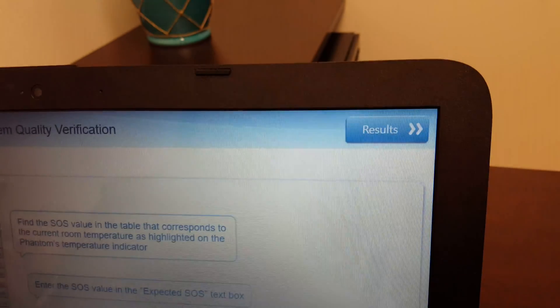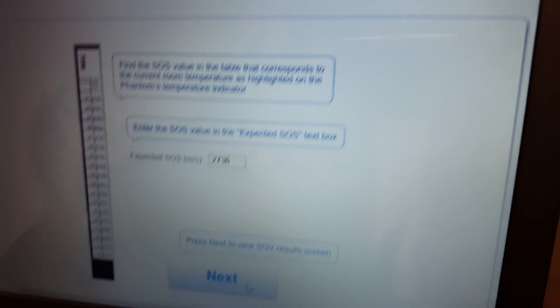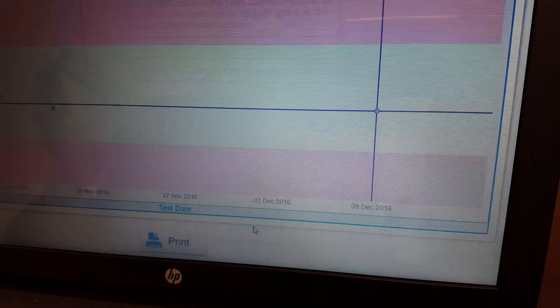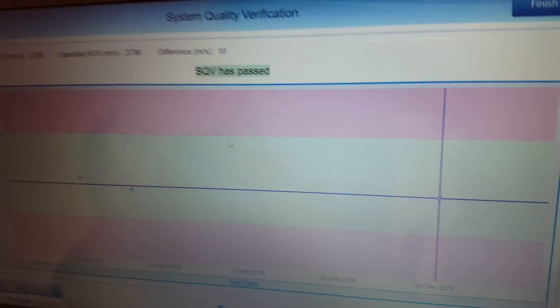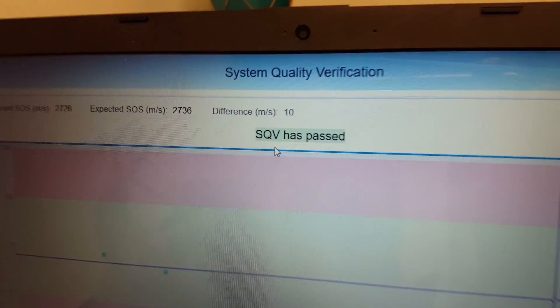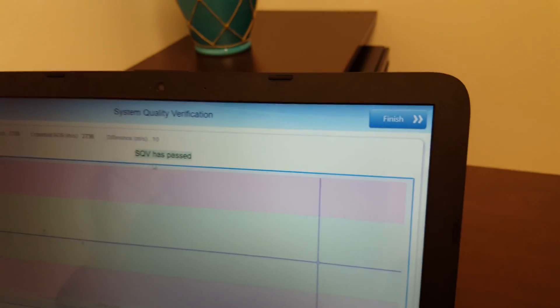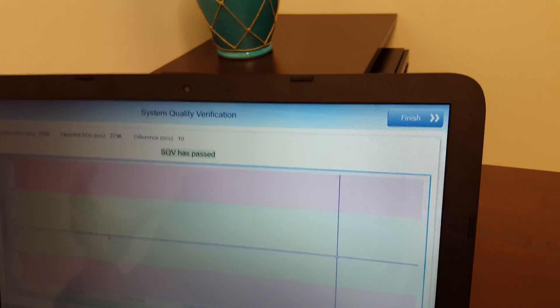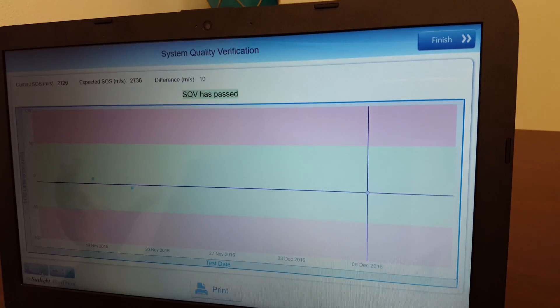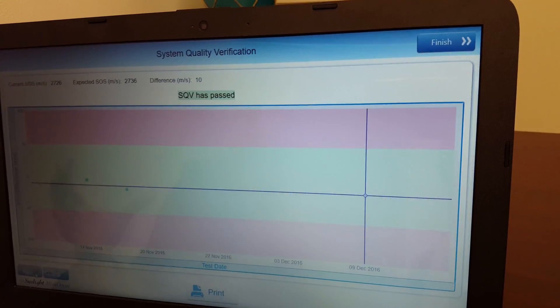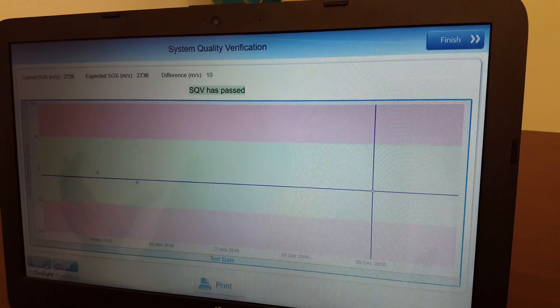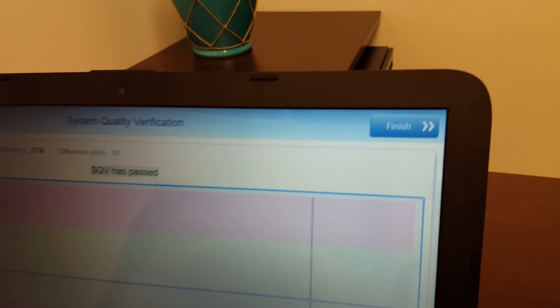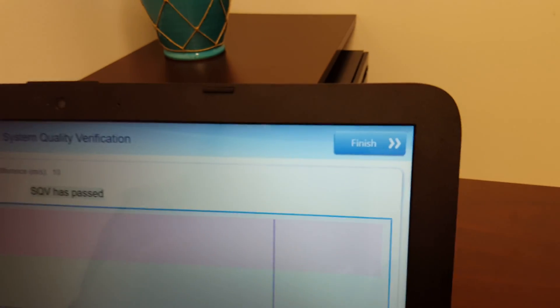And then simply press next, and it will let you know that the SQV has passed, and then the yellow triangle will have a green check. So you're all set to move on to scanning patients.